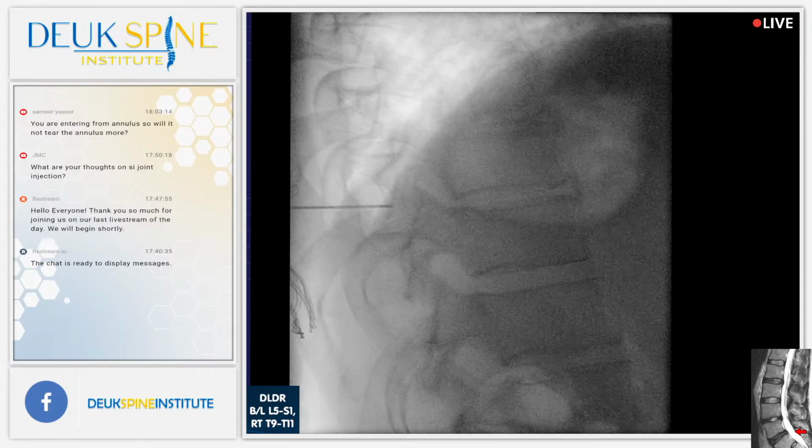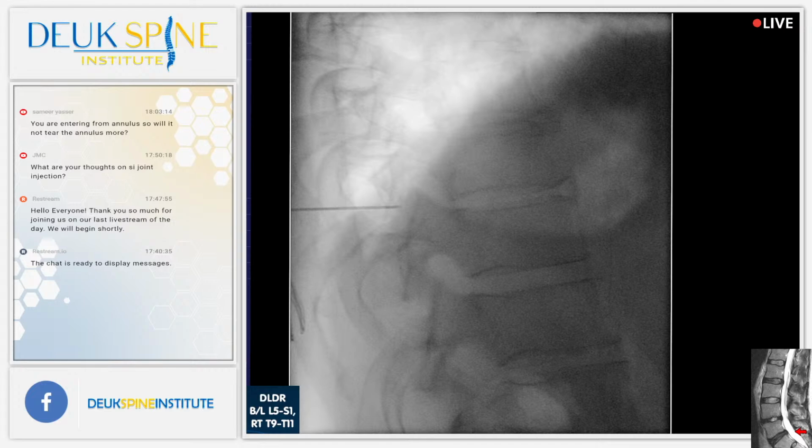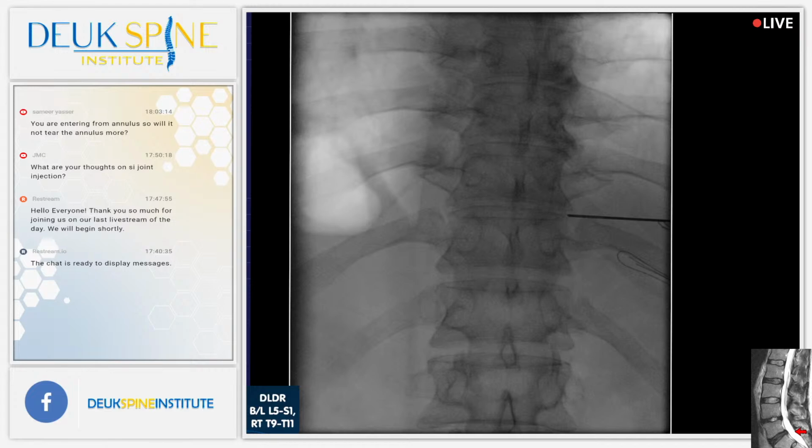Shot. Shot. Give me an AP. Yeah, but the key is it shows there's an injury. You said 30 years ago. Yeah. So it's an old injury. You can tell by the spurring. All right, so I'm still just a little bit too medial. 12, 11, 10. Everyone agree that's 10, 11, correct? That's one of the two discs we're doing.